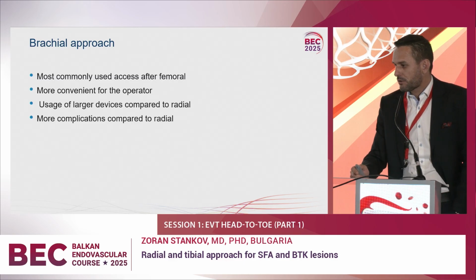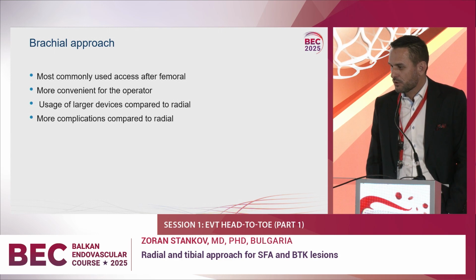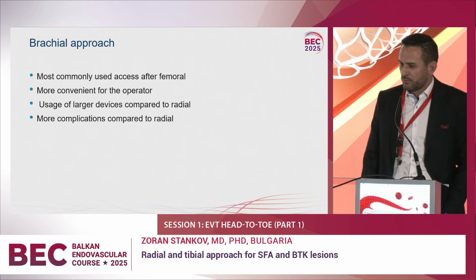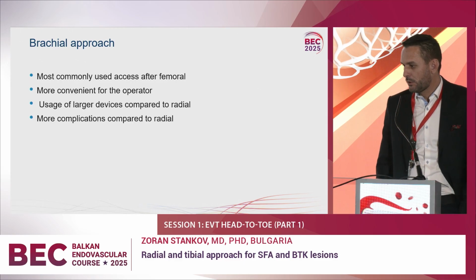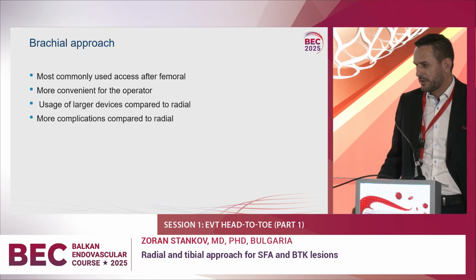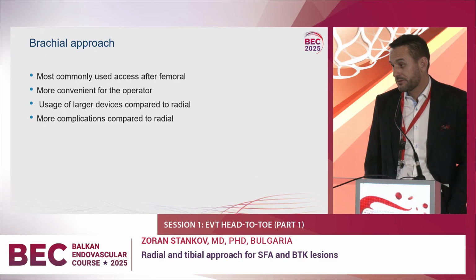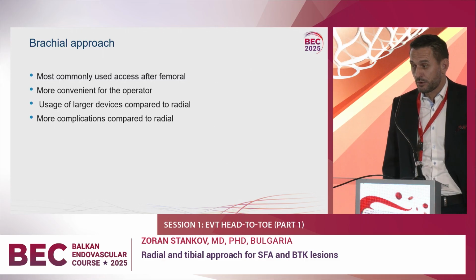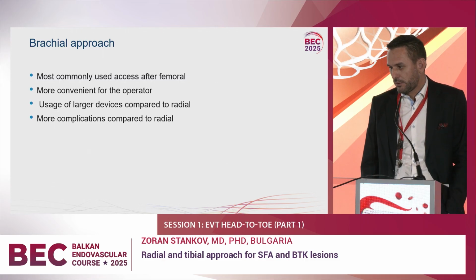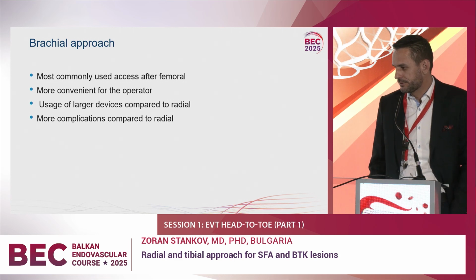It's more convenient for the operator using large devices compared to the radial, with more complications compared to the radial, but compared with the femoral approach, there is no difference. We have a publication comparing radial and brachial approach in 2,000 patients, and the result is that the brachial approach is safe for peripheral intervention. We use it for coronary intervention.